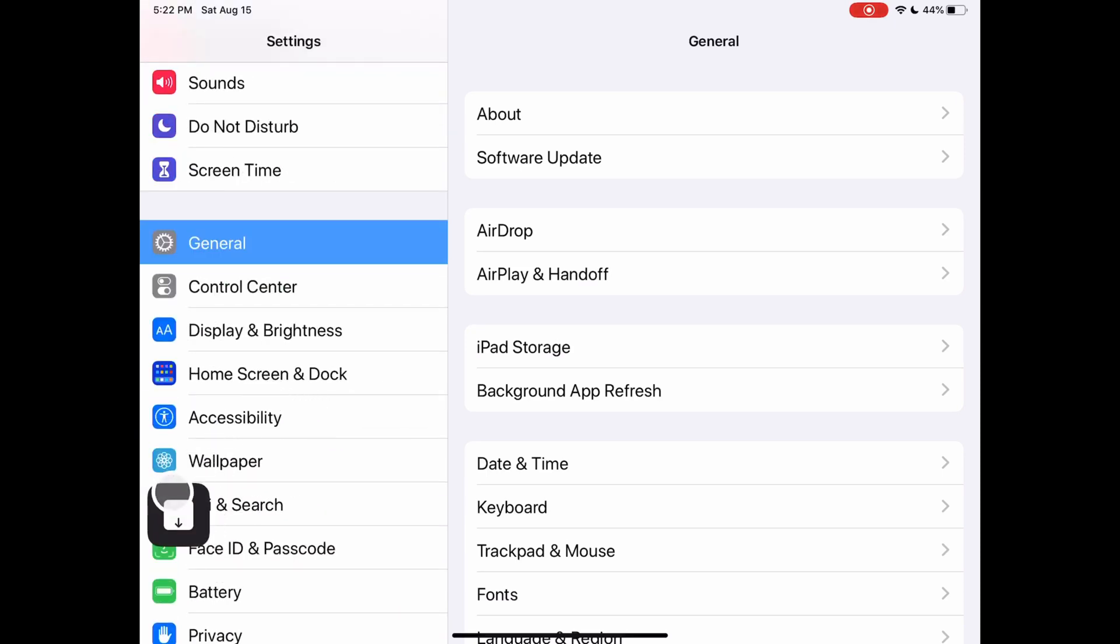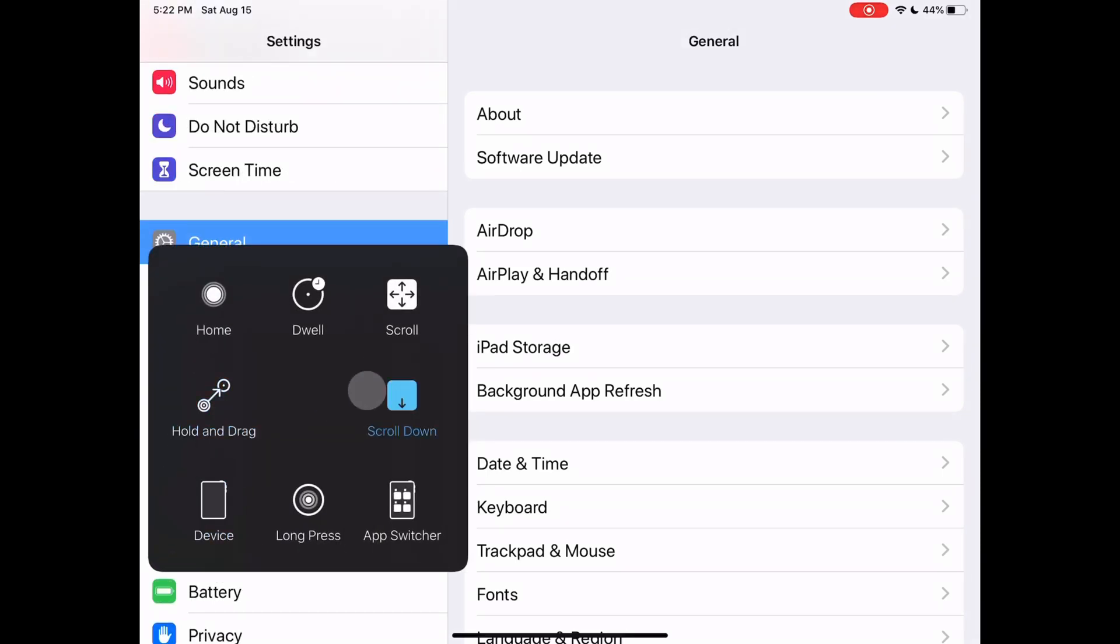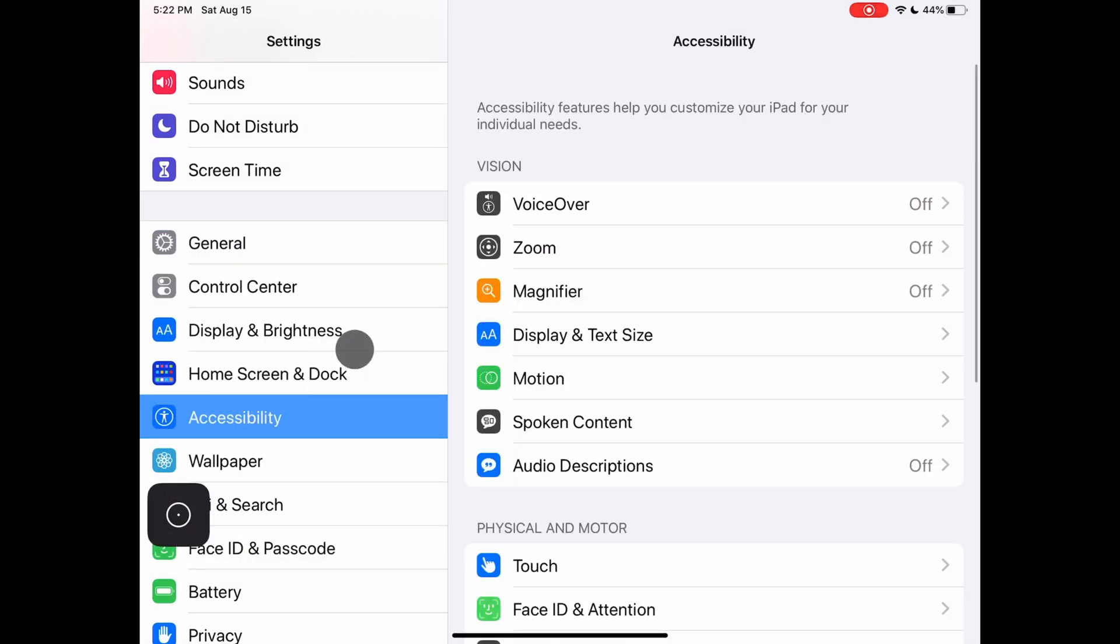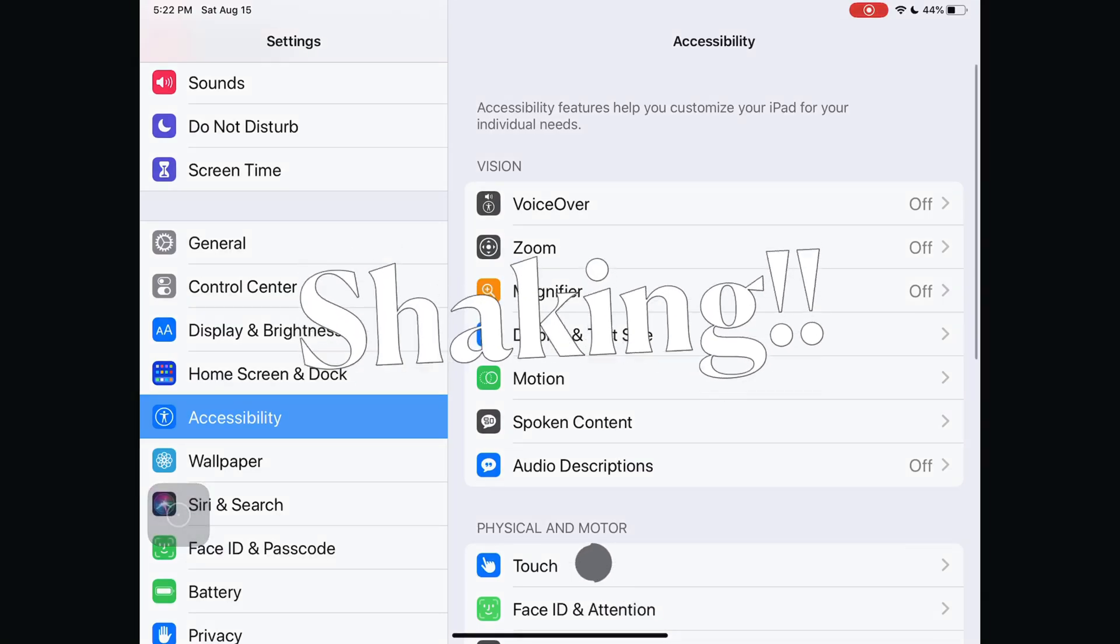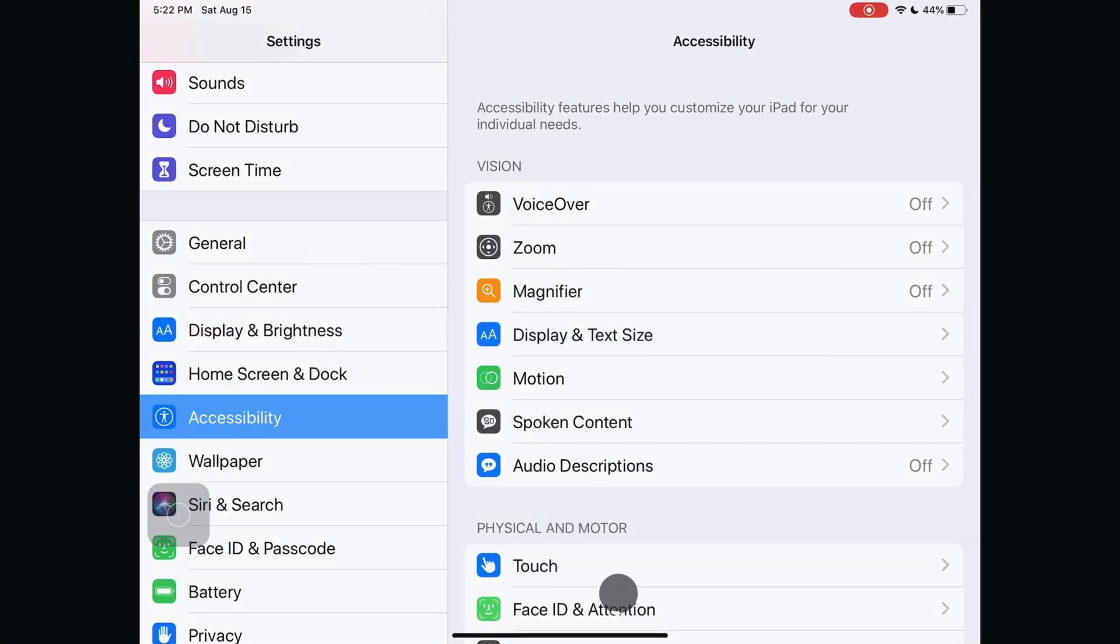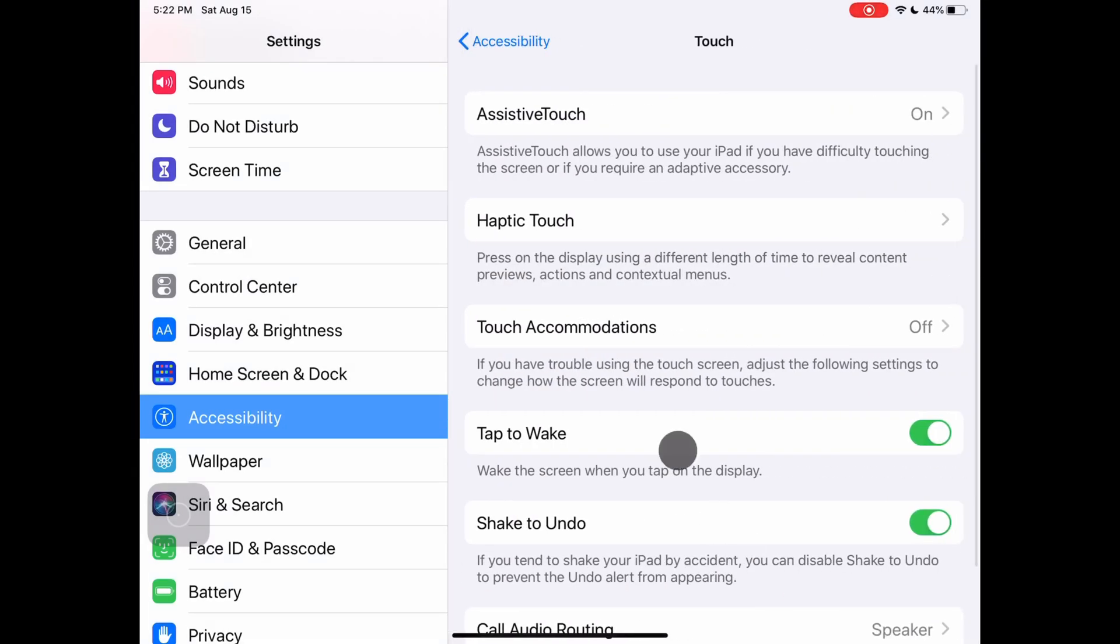Open settings. Scroll down to accessibility. Select touch. Select assistive touch.